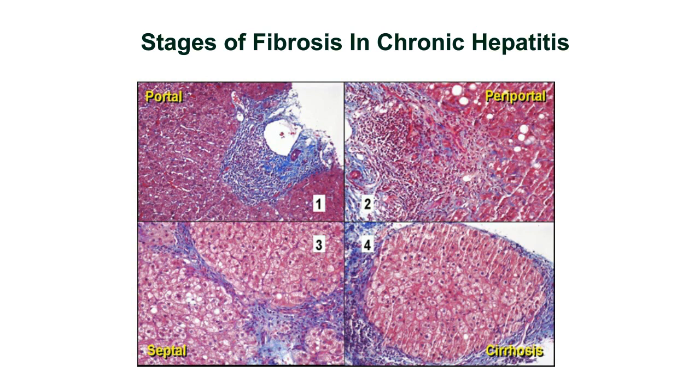Periportal means that the fibrosis extends out from the portal tract. And you can see here in the top right-hand corner that this periportal fibrosis, again, extends further out from the portal tract. And in the left lower photomicrograph, you can see here septofibrosis. Septum is just an arm. And typically what this means is that you have an arm or a bridge that connects either portal tracts or central vein to a portal tract. And this is now getting to what we call advanced fibrosis.